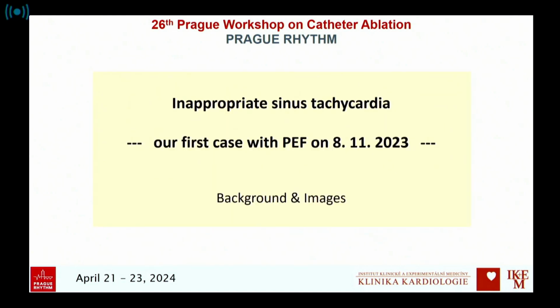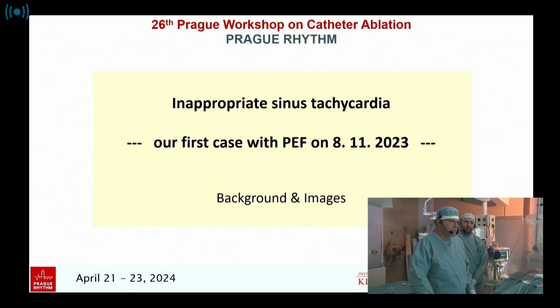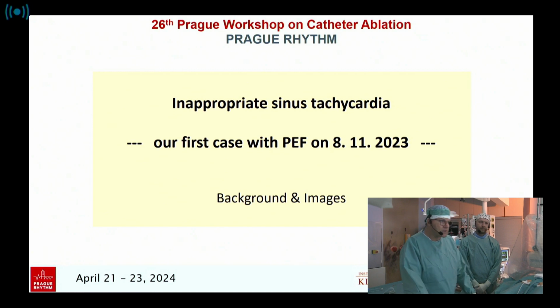Next slide. And I will continue just because this is completely new concept. I will try to give you some background, our experience, and I will show you some images from our previous procedures. We have very limited experience. We did 2 cases so far at the end of the last year and 1 in January this year.